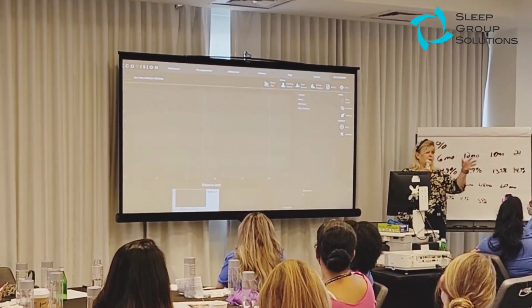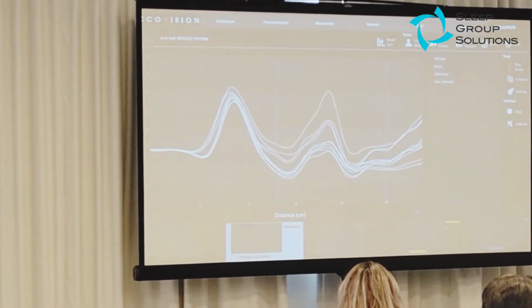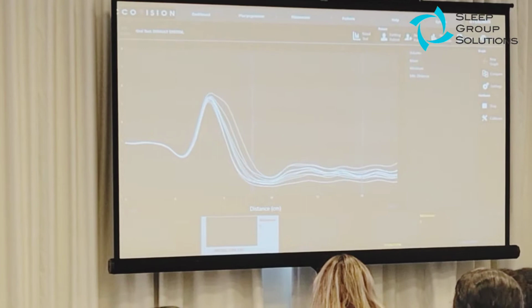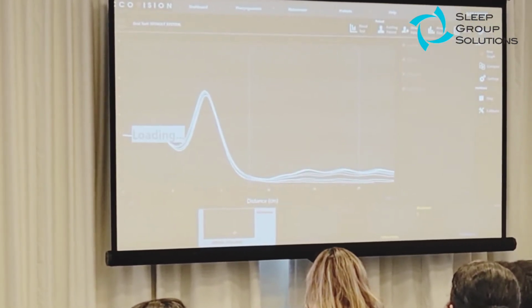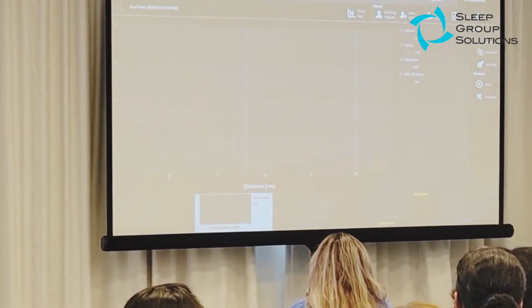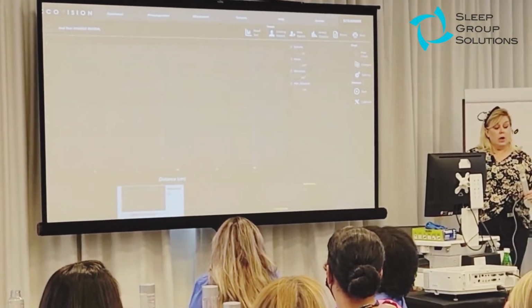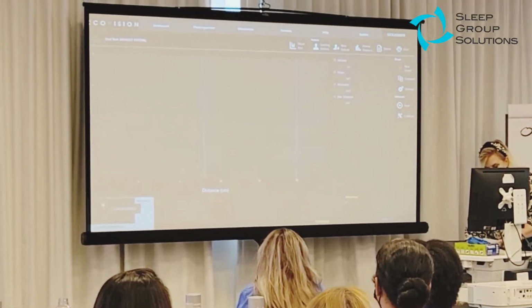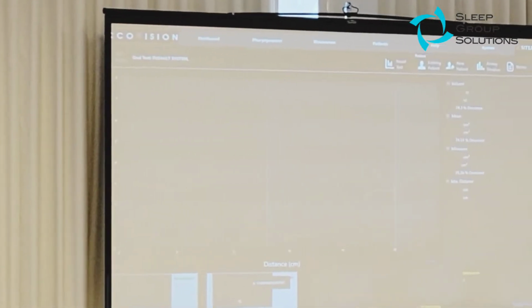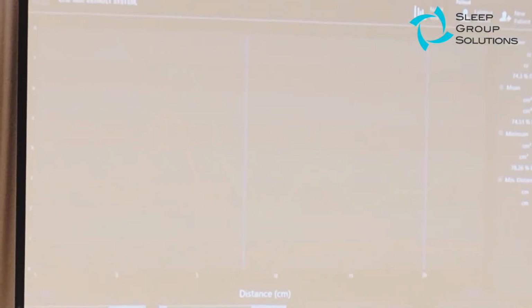This is real sexy blue in front of... That's my airway at night. I do have severe sleep apnea. I do wear an oral device for it. But that's my nighttime airway. So if this is, can you see it okay, hon? All right, so when I look at the two together, that's my daytime airway, and that's my nighttime airway. And I'm still awake, so do you think, if it's that bad when I'm awake, do you think it's better or worse when I go to sleep?